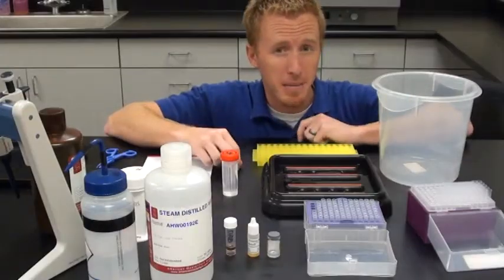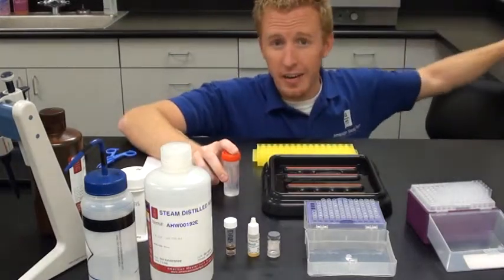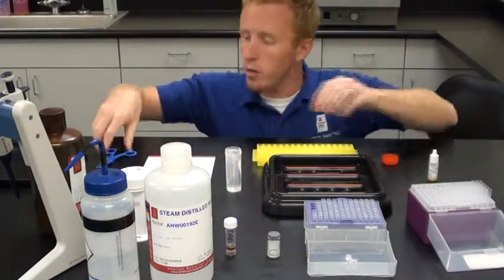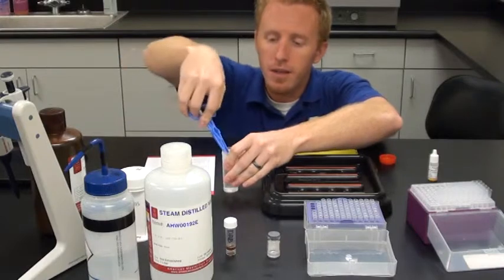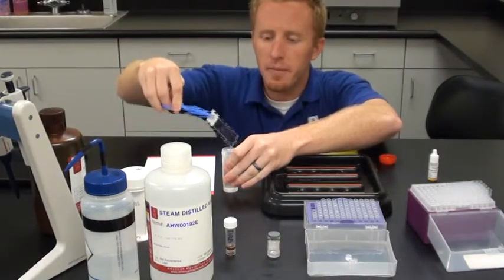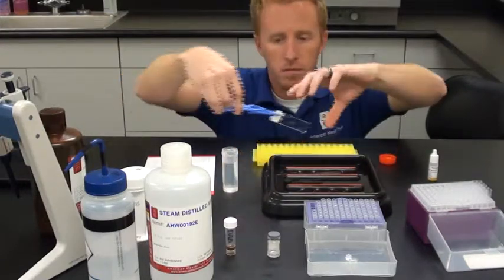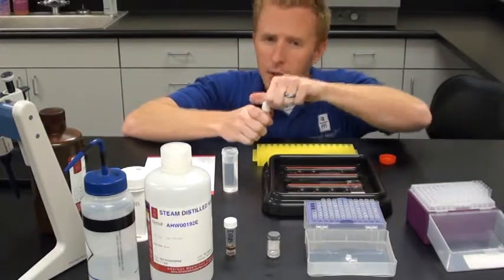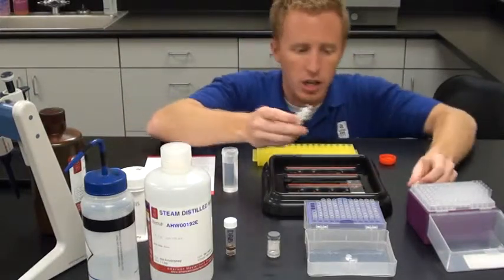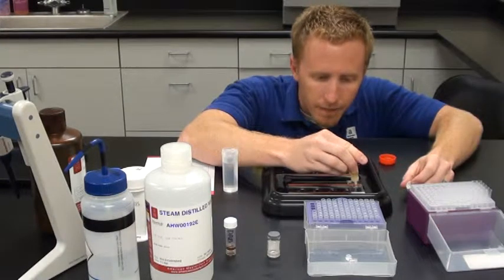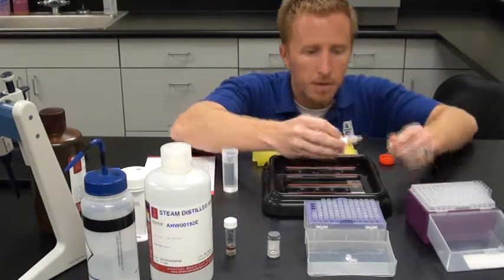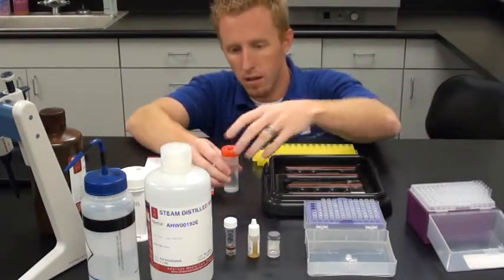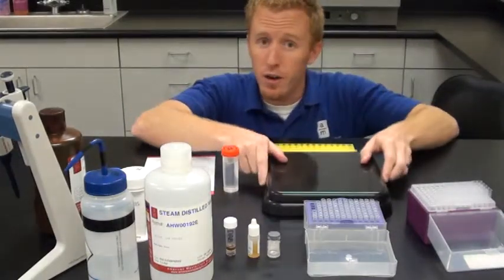After 2 minutes in PBS, it's time to apply our secondary antibody which is anti-mouse polymer HRP. We're going to remove the slide out of the PBS 7.4 and we're going to put it back into our humidity tray. Now again, as with everything you apply to the tissue section, you want to make sure you cover it entirely. That's it. Let it sit for another 30 minutes.